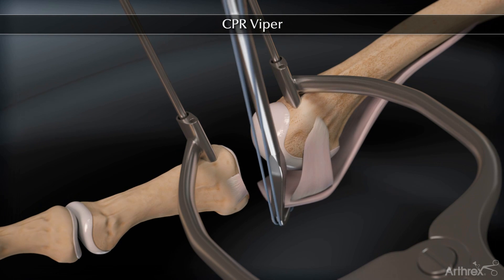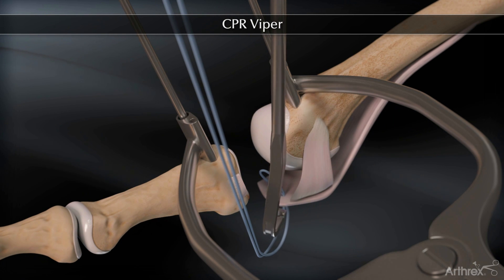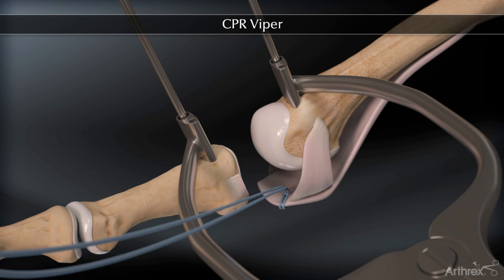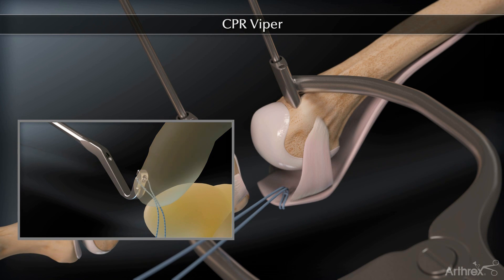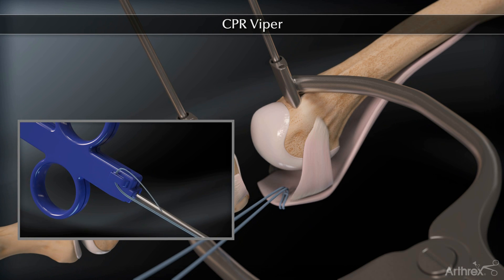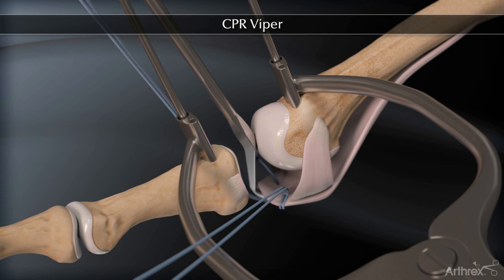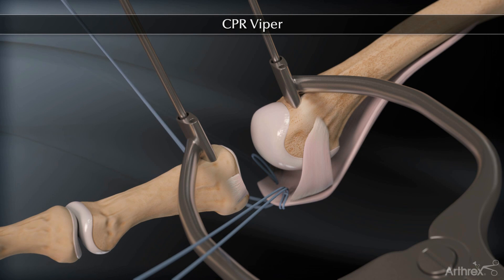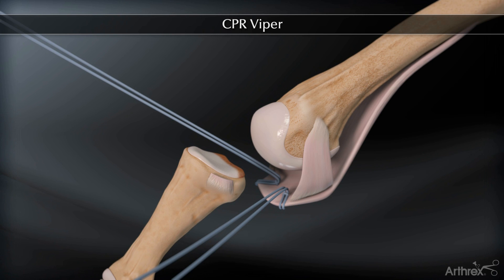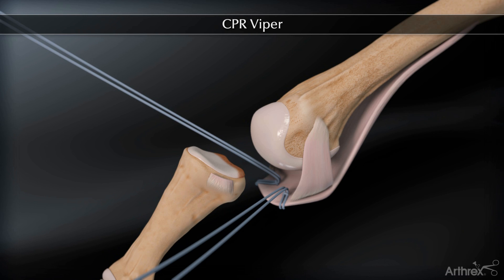The use of a preloaded VIPER enables us to pass a suture in the lateral plantar plate. You can reload the VIPER with O-fiber wire and pass a second cinch-type stitch in the medial plantar plate. Pass this suture as deep as possible in the plantar plate proximally in order to really gain control of the plantar plate and place the suture in stout tissue. If you are too close to the bleeding edge of the plantar plate, you may not have secure tissue or a secure suture. You can also pass additional sutures with the VIPER in the medial and lateral collateral ligaments if desired.